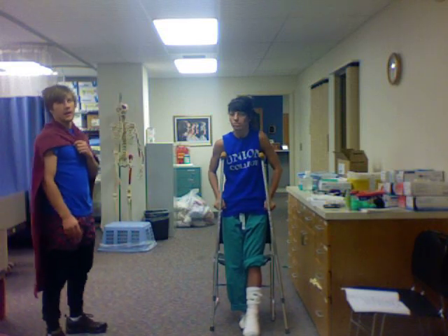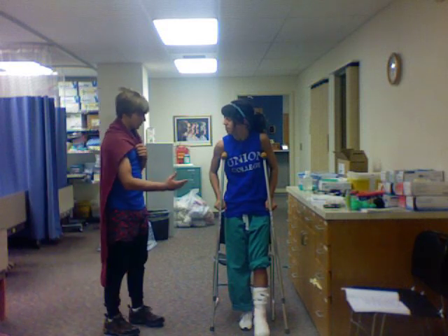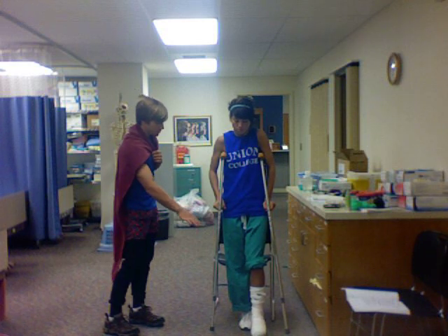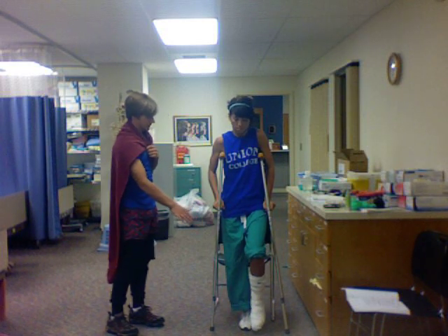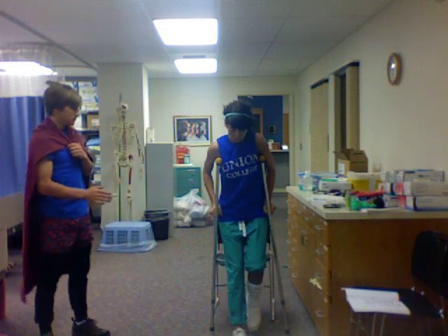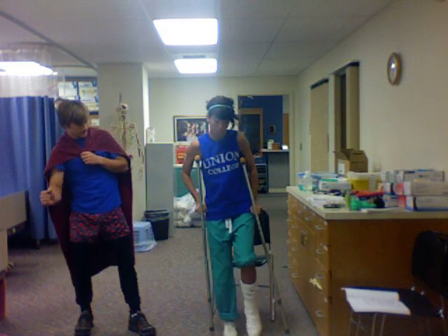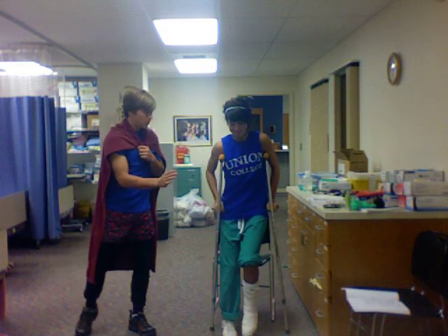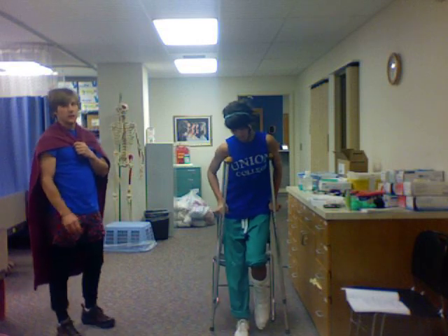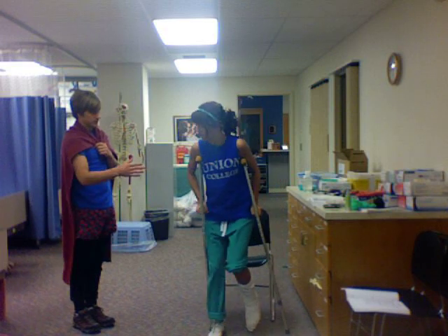Wonderful. Now what I'm going to have you do is get comfortable with your crutches. Remember not to put weight on your affected leg. I would like you to just sway back and forth and get comfortable with the crutches — just sway back and forth, come right, come left. Do you feel comfortable with balance, swaying side to side, forward and backward?